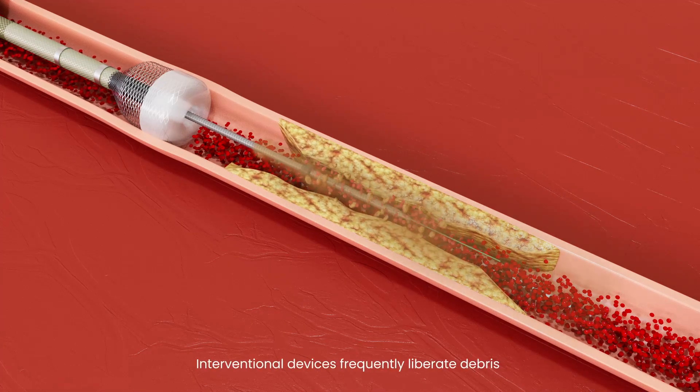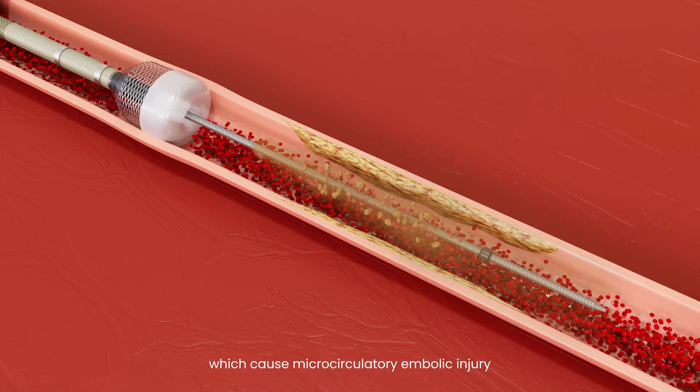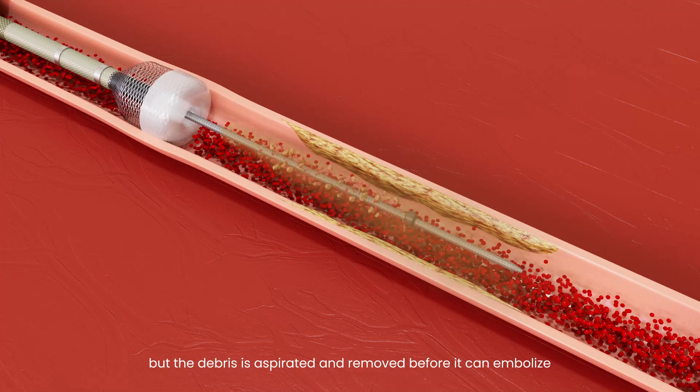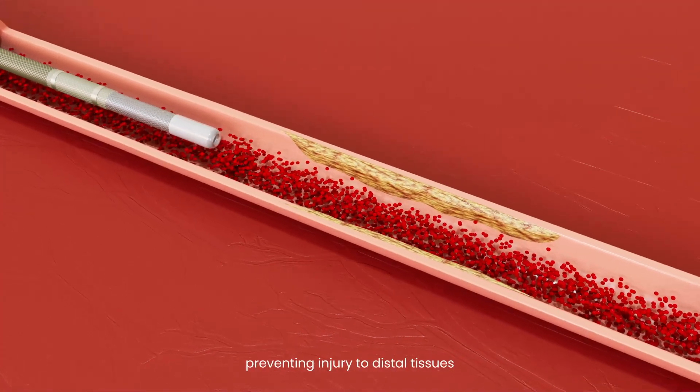Interventional devices frequently liberate debris which cause microcirculatory embolic injury, but the debris is aspirated and removed before it can embolize, preventing injury to distal tissues.